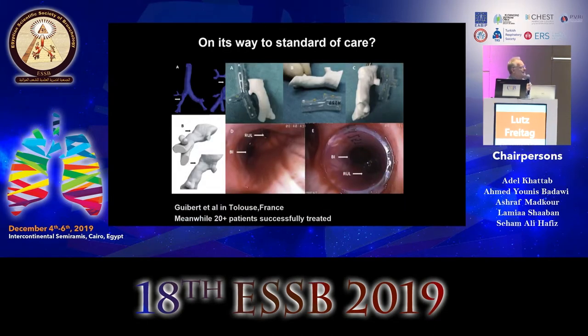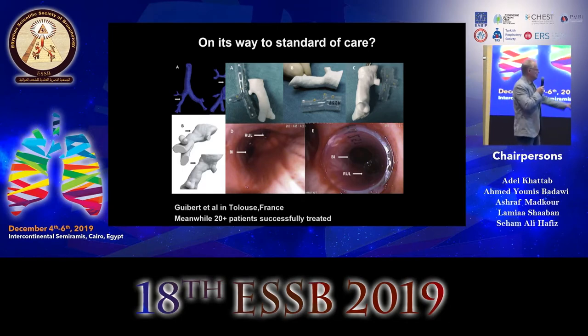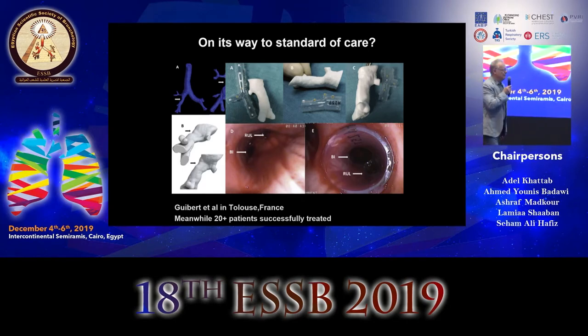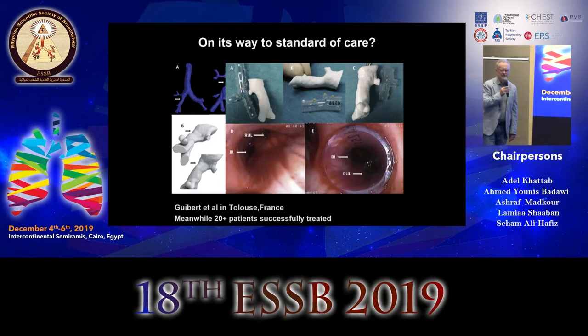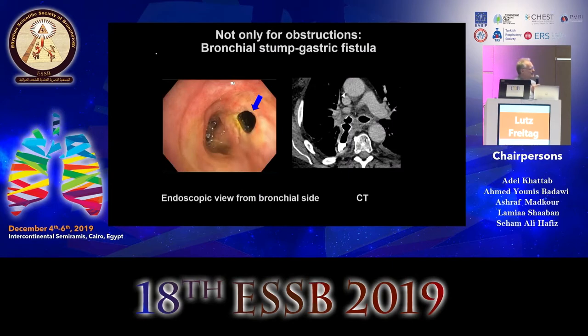And I bet that eventually it will become kind of standard of care. The last paper, the Blue Journal from the Toulouse group, showed that 20 patients were successfully treated without major complications. These types of stents cannot only be used for dealing with obstruction, but for example, sealing fistulas.